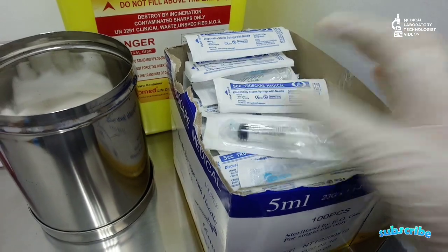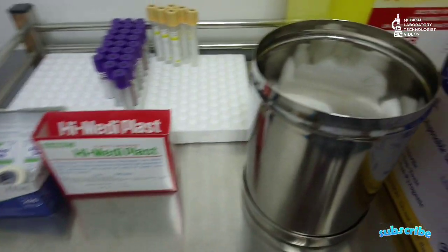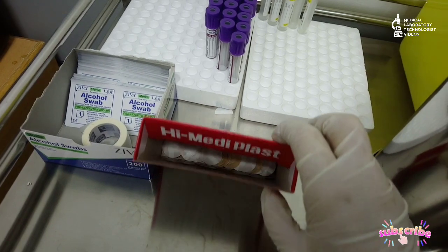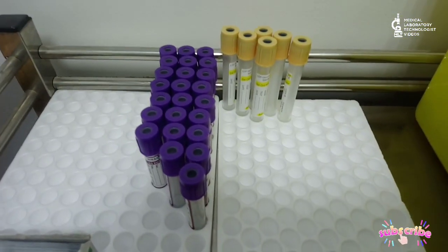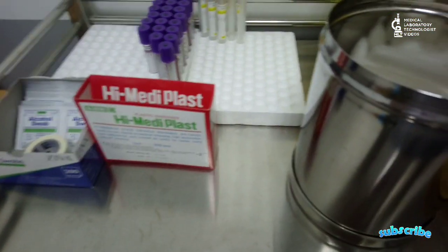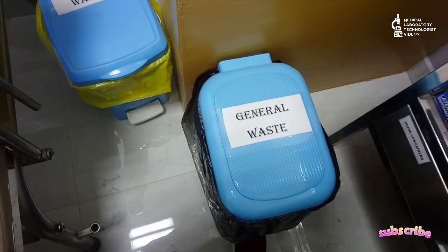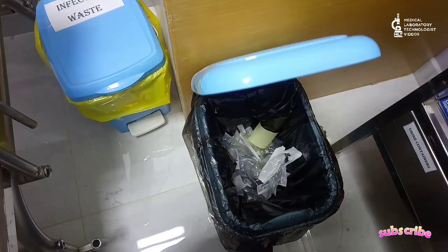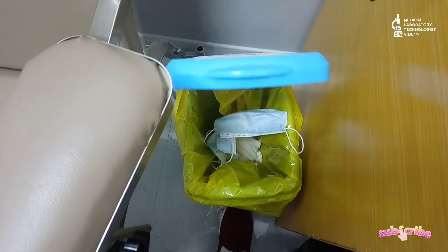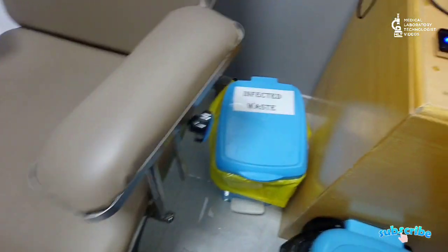First of all, the items you need in the sample collection room: syringes, sterile cotton swabs, and alcohol swabs. If alcohol swabs are not available, you can use spirit. You also need spot bandages to close the vein area after sampling, sample tubes, a sharp container for discarding needles, and gloves. You also need general waste and infectious waste bins — general waste for covers of syringes and stickers, and infectious waste for items that contact you or the patient directly, like gloves, cotton swabs, alcohol swabs, and masks.